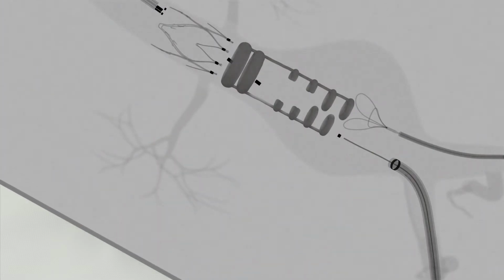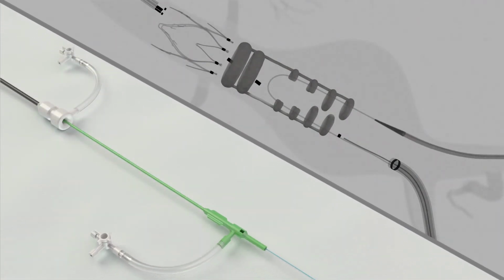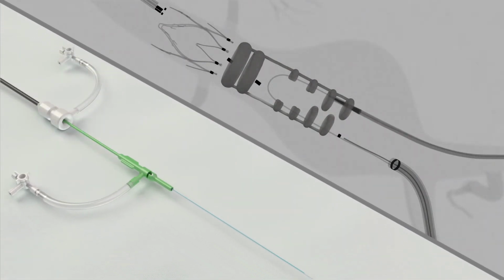The wire traverses a built-in PTFE lumen up the ipsilateral leg and across into the contralateral leg. The wire exits the crossover lumen at the second ring on the contralateral leg. With the snare catheter, externalize the 018 guide wire through the contralateral sheath. Insert a 5 French sheath over the contralateral crossover guide wire.